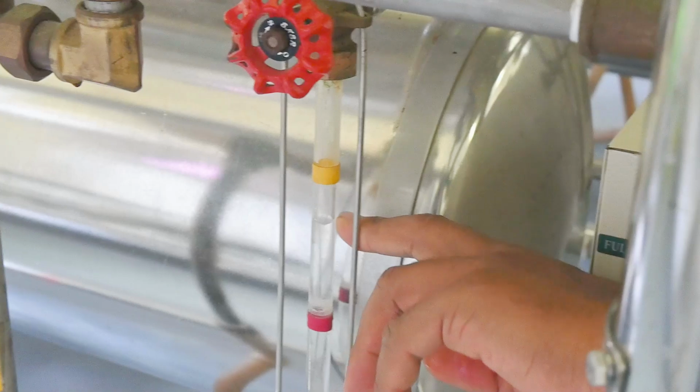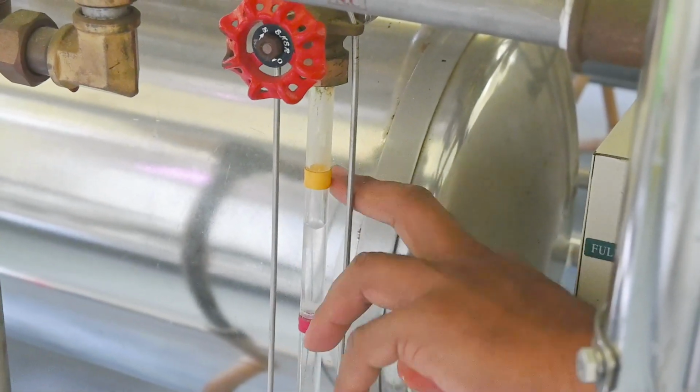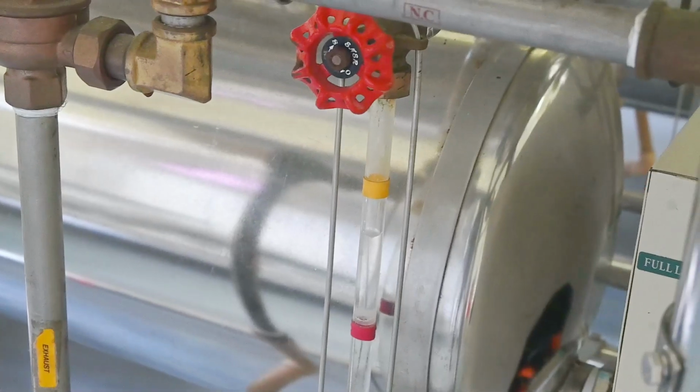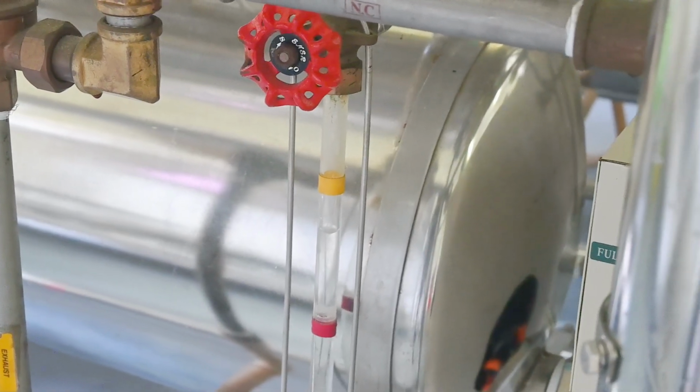This is the current level of where the water is at. That's the range it must not go below, and that's the range it mustn't go past. So while I'm filling it, you'll see what happens with the water, and we'll get it to the level where it is operationally sound.